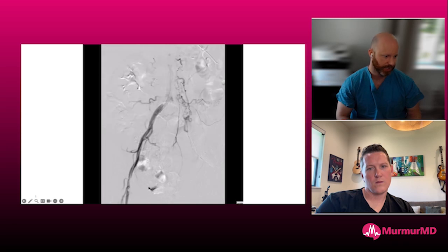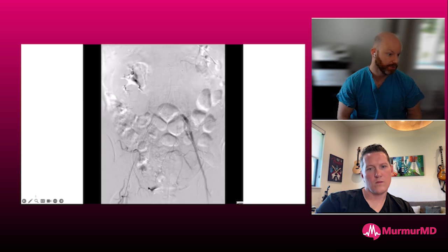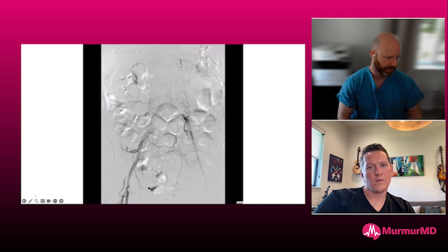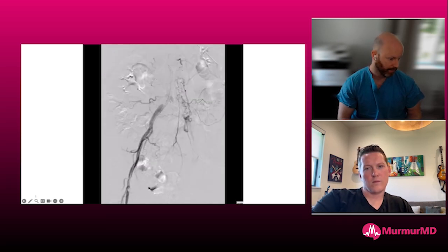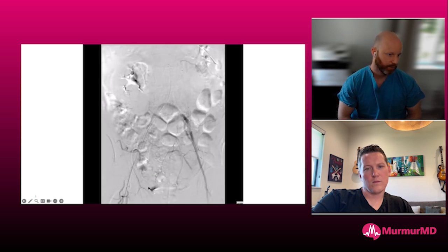But this is also reassuring for the patient on the floor because she's gotten sedation, maybe she's gotten some anesthesia. And if there's some hypotension, you have pretty good confidence that one, your stick wasn't retroperitoneal anyway, but two, that no other thing happened with implantation of the peel away or the Impella itself, at least in the abdominal aorta, to cause an RP bleed. You know that you're not bleeding from your access site. You just have some reassurances, and I think it's good for patient safety.